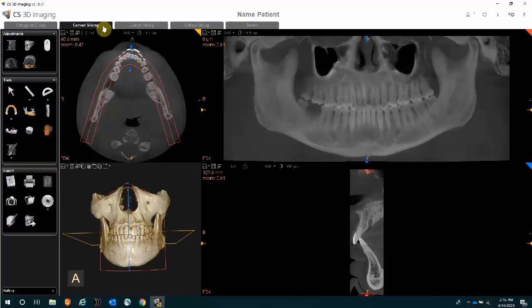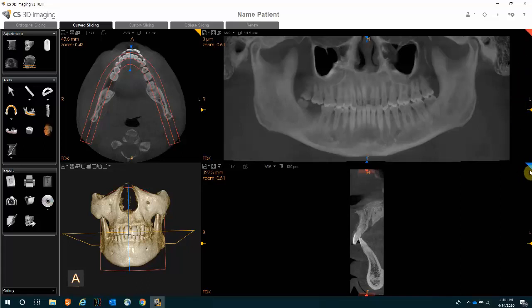Now let's go over the steps on how to find or best find our potential implant site. With the software open in a curved slicing tab, you will notice that the software automatically creates a panoramic view labeled with a red color, and at the same time you have a cross-sectional view labeled with a blue color. You're welcome to use what the software gave you.